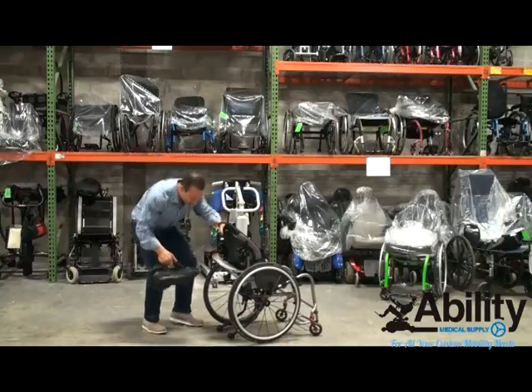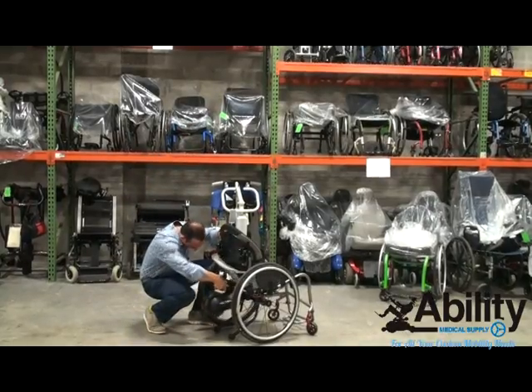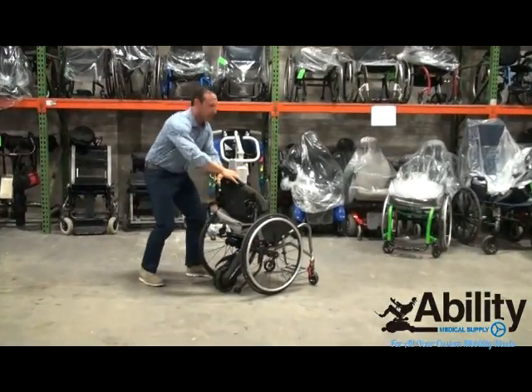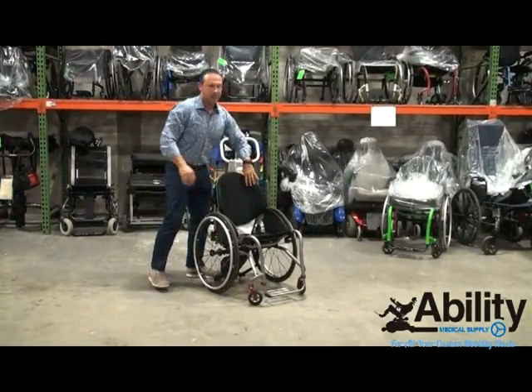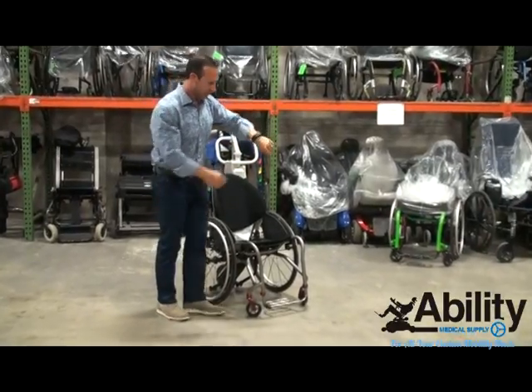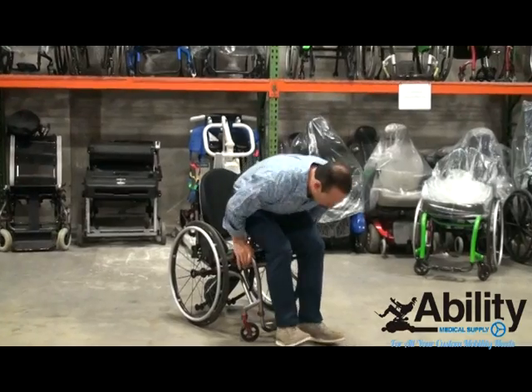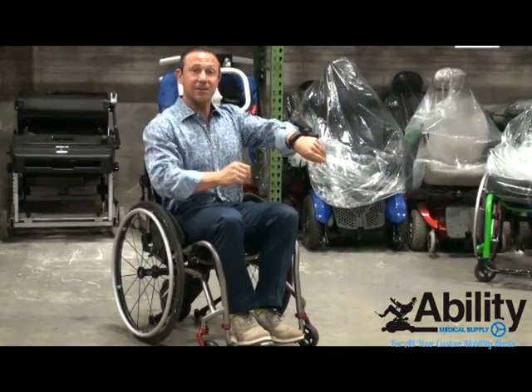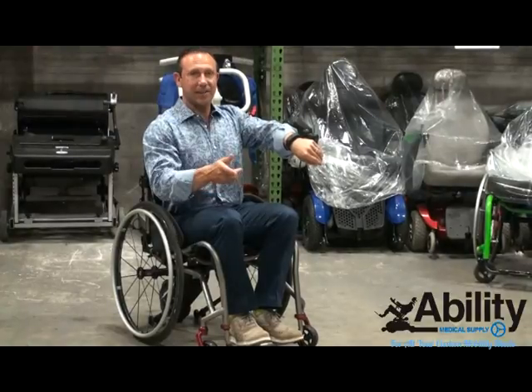It just mounts really easily like this. We power the unit up. I have my trusty bracelet. Once I sit in the unit, I push the button here on the trusty bracelet. That activates the system.